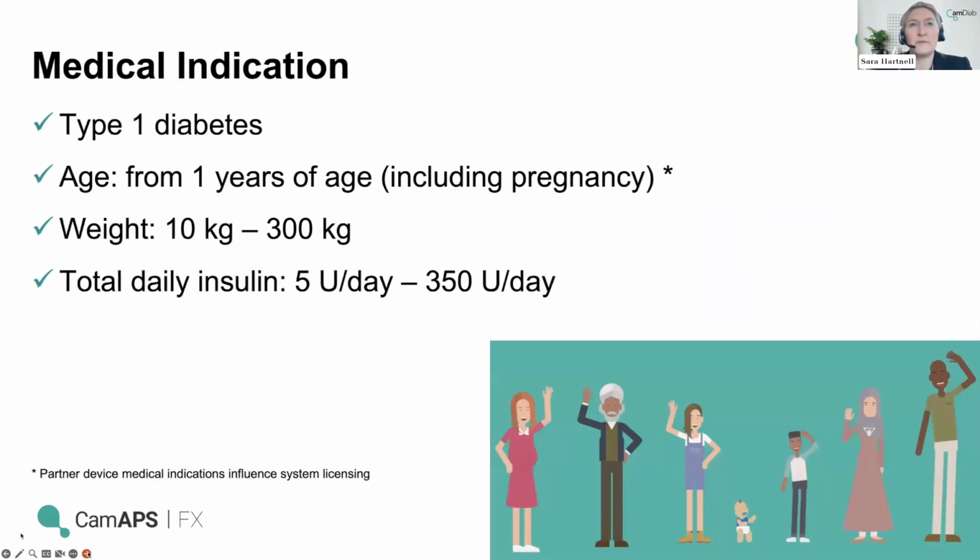Just before we start, in the interest of time, I'm not going to go through the outcome of the AiDAPT study. I'm assuming the majority of people will be familiar with that data if you work in diabetes in pregnancy. We're obviously really thrilled with the trial results. They showed an increase of over 10% time in range in the pregnancy target range compared to usual care with CGM, and a reduction in A1C and a reduction in overnight hypos.